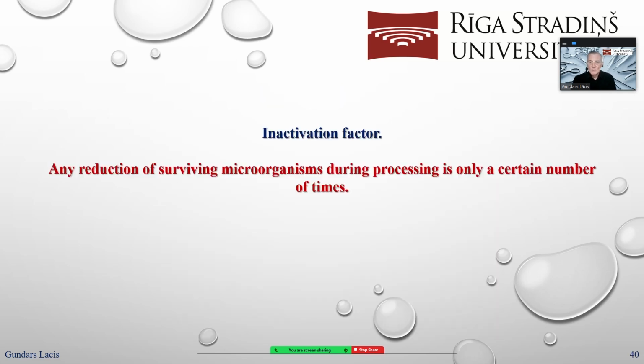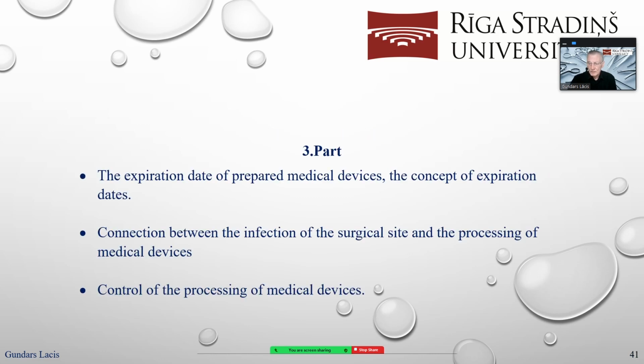So, one more time: any reduction of surviving microorganisms during reprocessing is only a certain number of times. Please remember this. Okay, now we'll go to part 3.